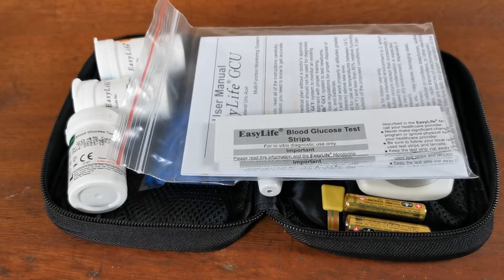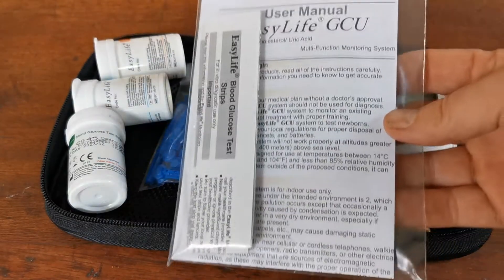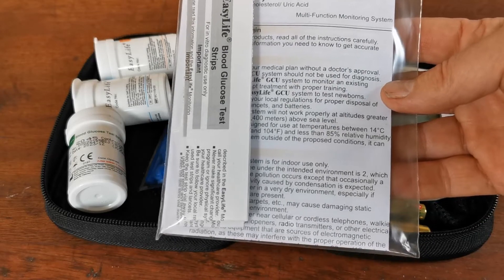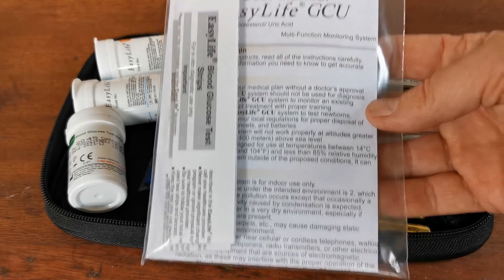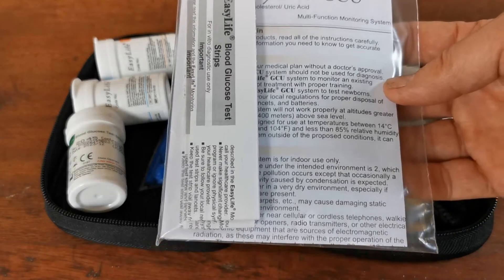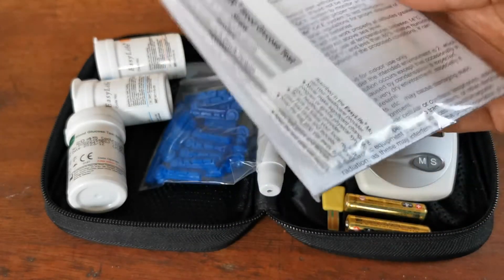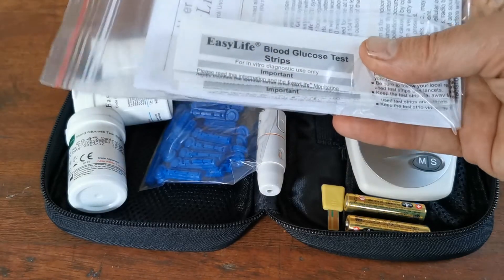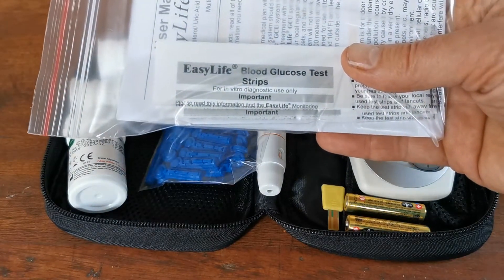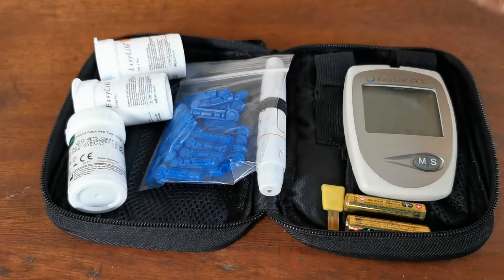Here we have the contents of that box. First, on the outer side — not included in the pouch — is your user manual. This is a very well-written, full easy-English instruction guide. It gives you loads of information, though you're probably not going to read through all of it until you want to start testing. Also included are three strip test advice or instructions for use.